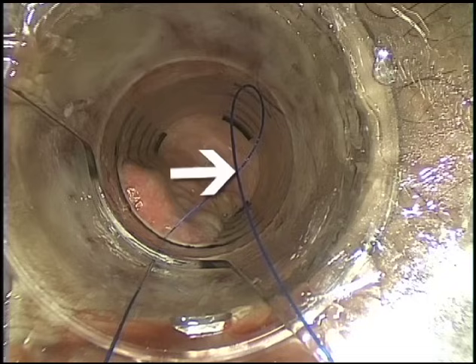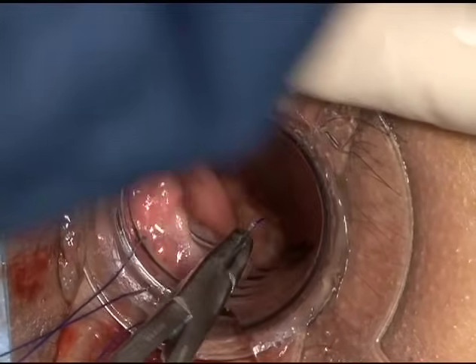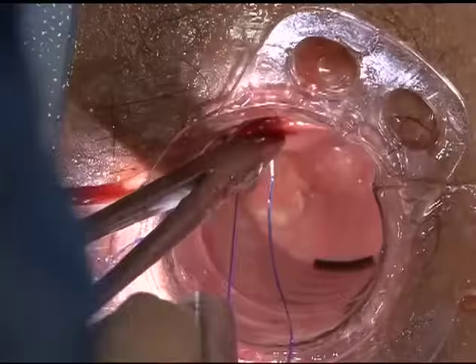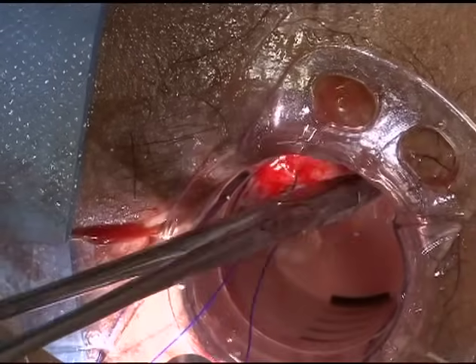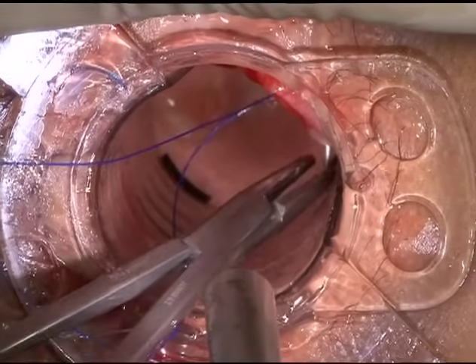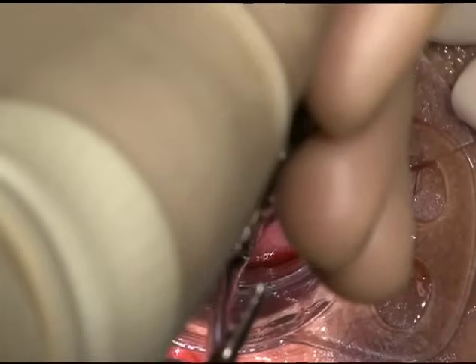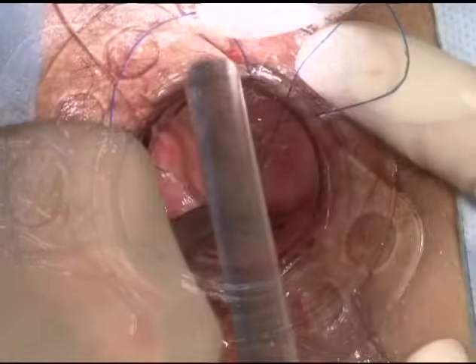The anoscope with the EEA hemorrhoid stapler kit has uniformly placed circumferential graduations that help to guide even purse-string placement. Using the anoscope graduations to maintain a consistent circumferential placement, create a purse-string suture in the mucosa and submucosa. The purse-string should be positioned to capture the desired amount of prolapse and position the final staple line appropriately proximal to the dentate line. The appropriate location may vary within the range of the markings depending on degree of prolapsed mucosa and the desired amount of tissue to be removed.